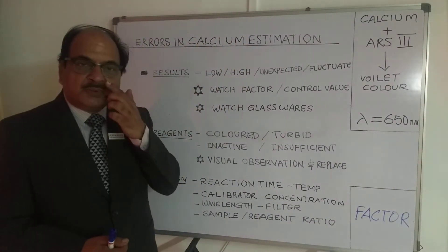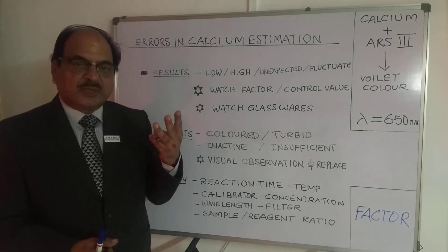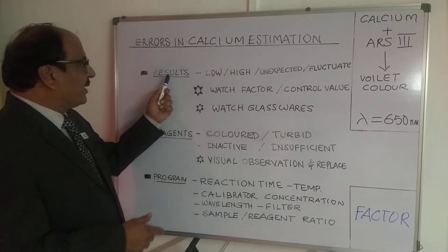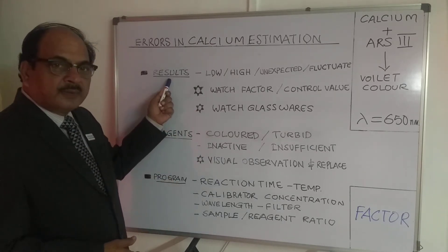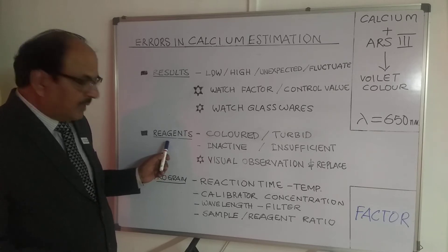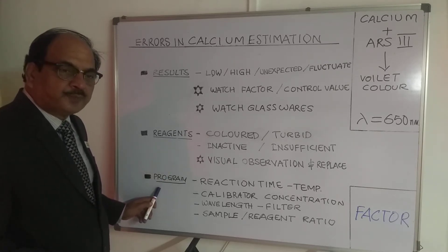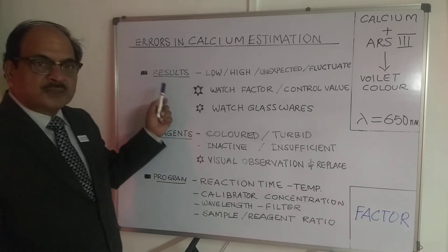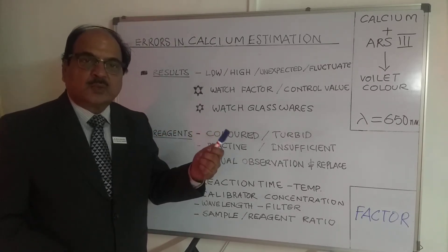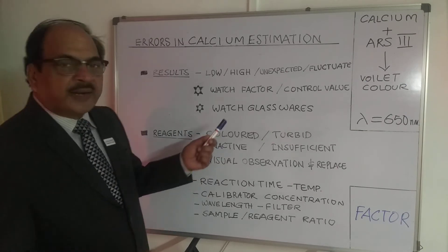Now let's come down to the kinds of results and errors. There are three categories into which all errors fall: the first is result-oriented errors, the second is reagent-related errors, and the third is program-related errors. Let's begin with result-oriented errors.